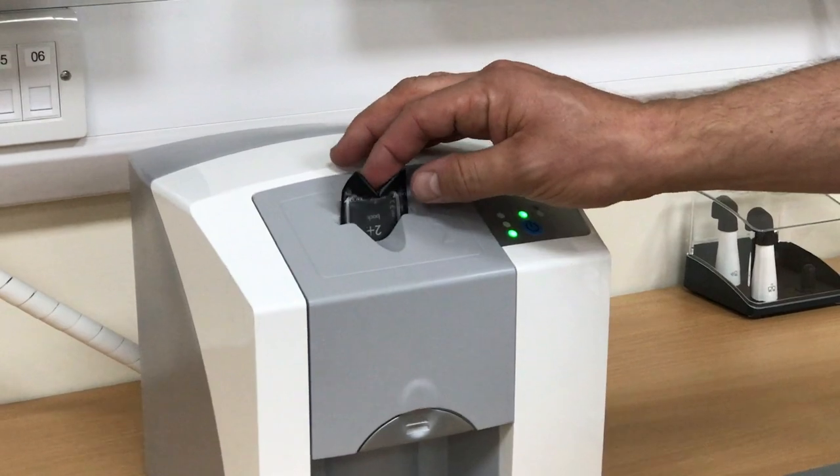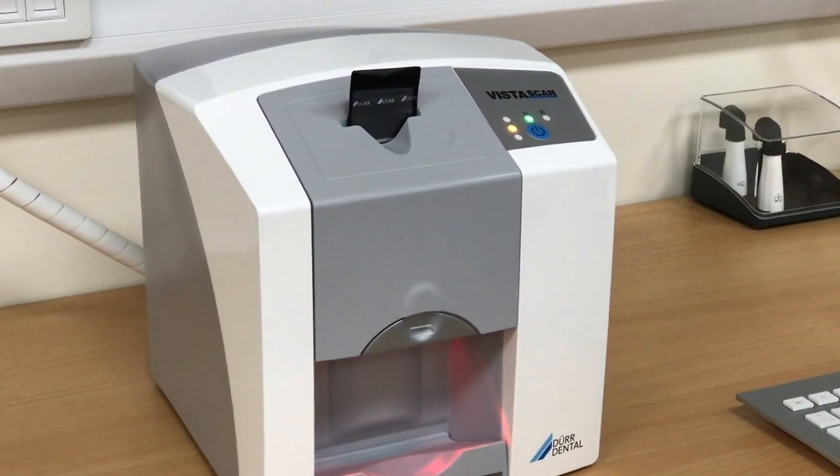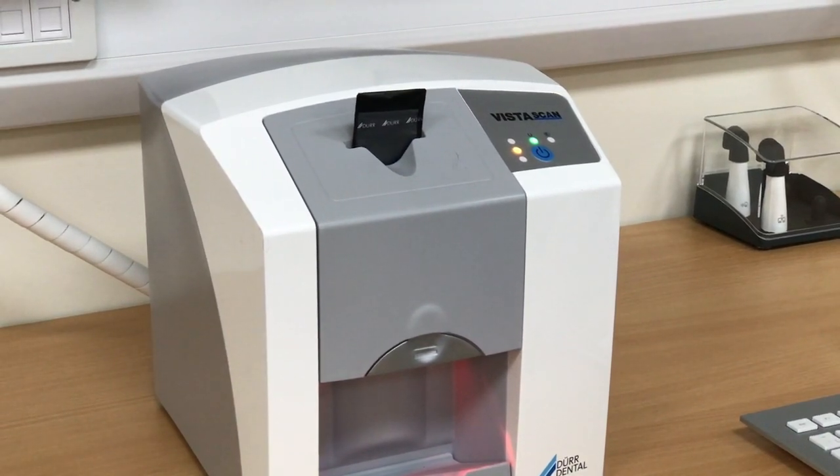With a gentle press of the image plate, the scanner should eject the plate from the barrier envelope and your image will appear on the screen.